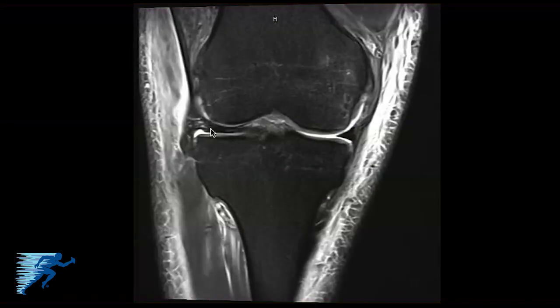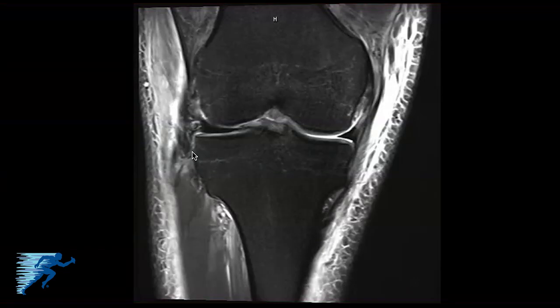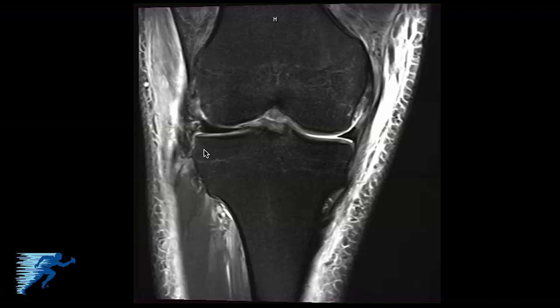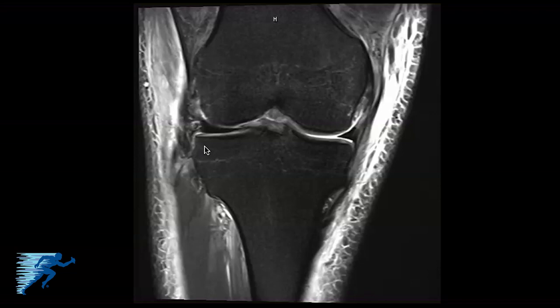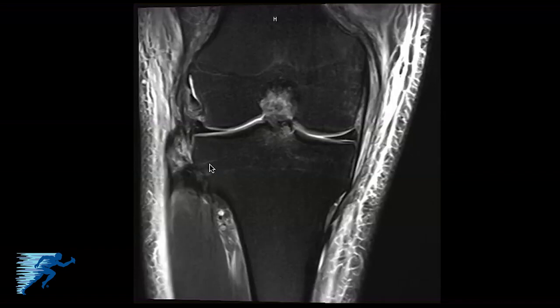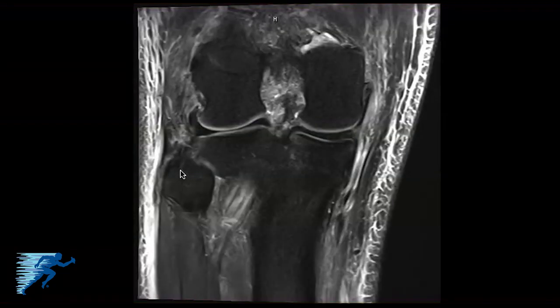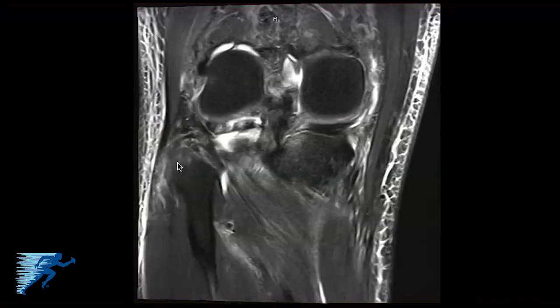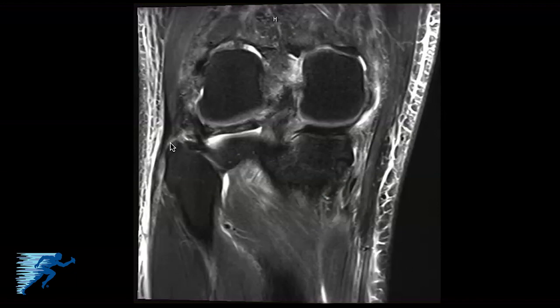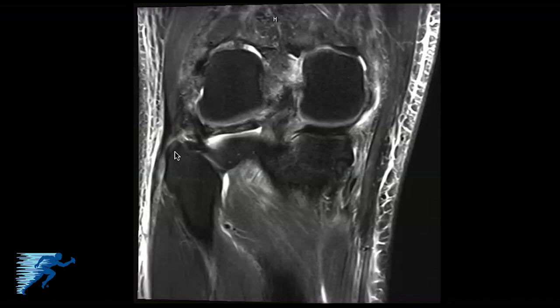Here's the lateral meniscus. We can see a disruption of the meniscal tibial portion of the lateral capsule, commonly called the mid-third lateral capsule ligament or the anterolateral attachment site of the anterolateral ligament. This is the fibular head, and we can see some intersubstance changes within the biceps femoris along here, where the biceps femoris has been peeled off the fibular head. Here's the top of the styloid, and you can see signal between the biceps femoris muscle and the tendon at its attachment to the fibular head.